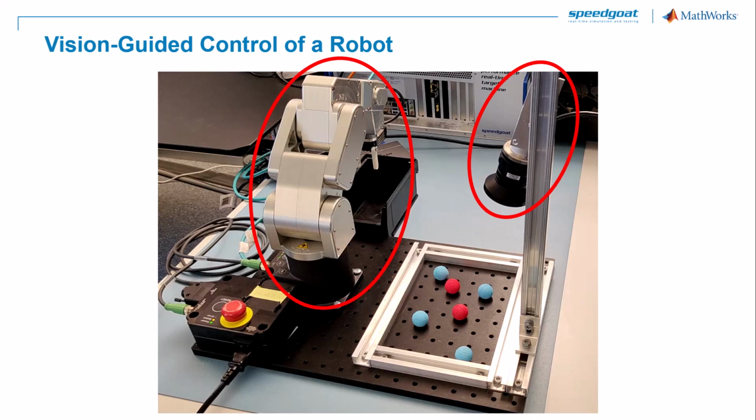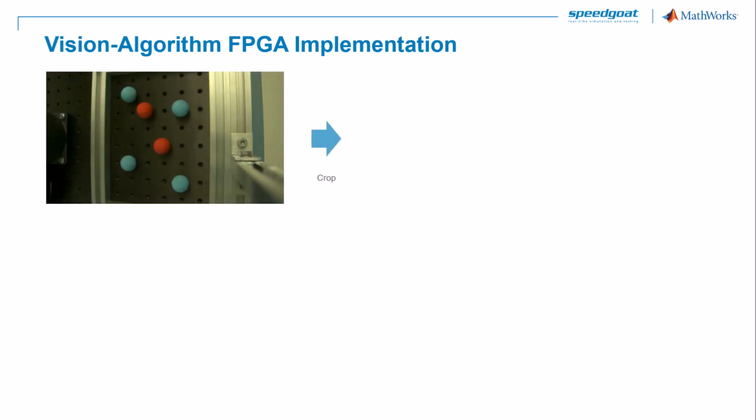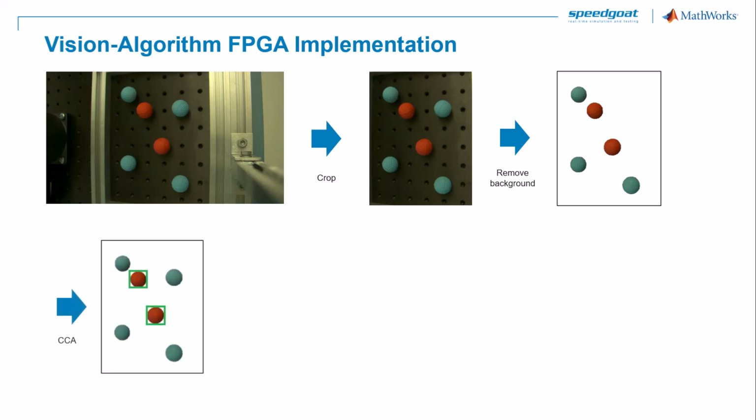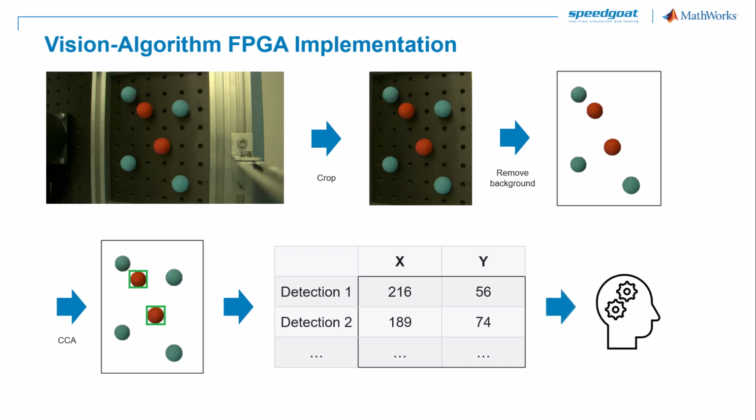Let's first see how the computer vision algorithm works on a very high level. The overhead camera image is cropped to the area of interest and thresholding on an intensity image is used to remove the background. An algorithm for connected component analysis, or CCA for short, then calculates bounding boxes and center coordinates for each object, and we filter them by primary color to detect the red balls. Finally, we transform the detections from pixel coordinates into the robot's reference frame and send them down the data stream.